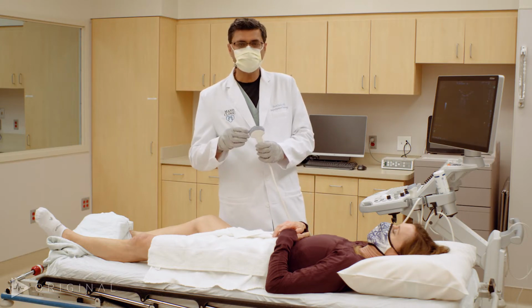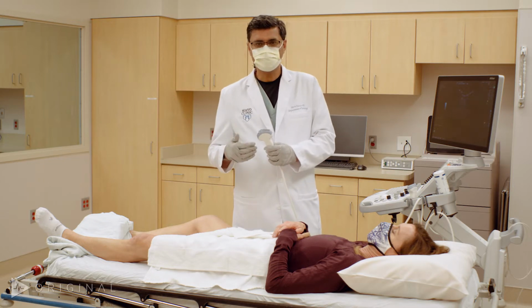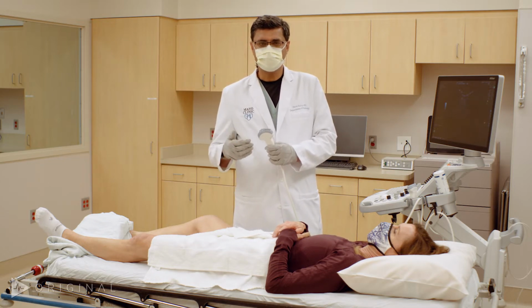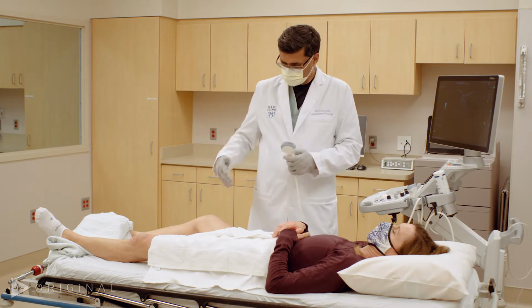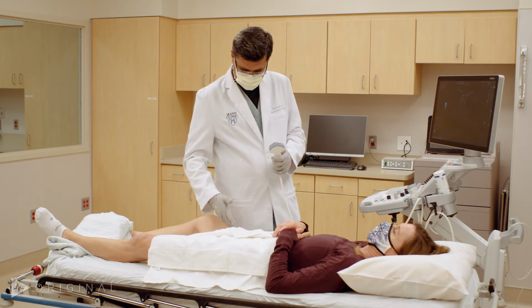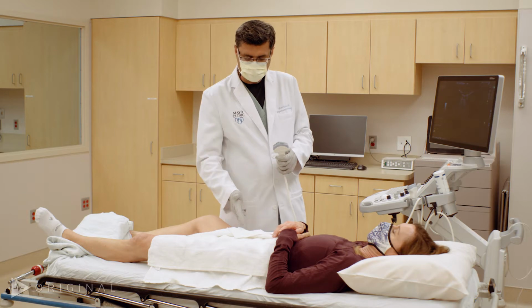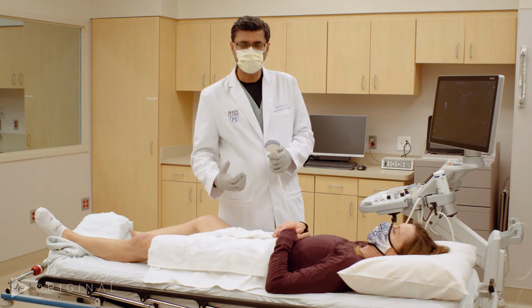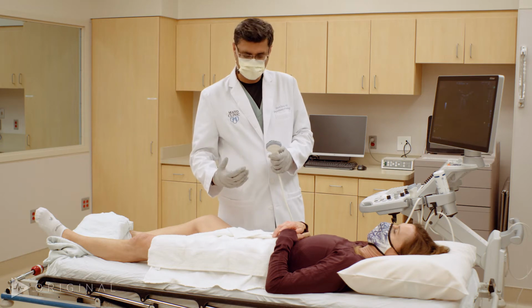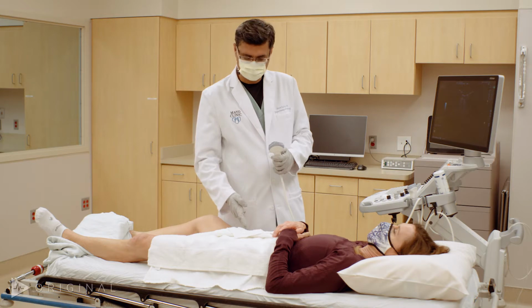The reason we do this is because of the depth. As you know, in ultrasound, the deeper you have to go, the lower the frequency. So for a hip joint, we prefer a curved transducer. Now you have to imagine that the femur goes in this orientation, and then the neck of the femur is a little bit more oblique. So we are not going to follow the anatomical planes when we do the ultrasound exam, but we will define the planes based on the orientation of the femur itself.